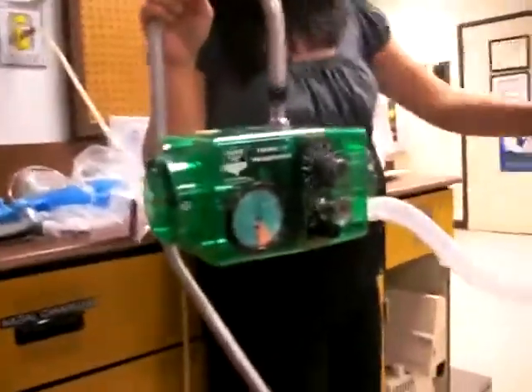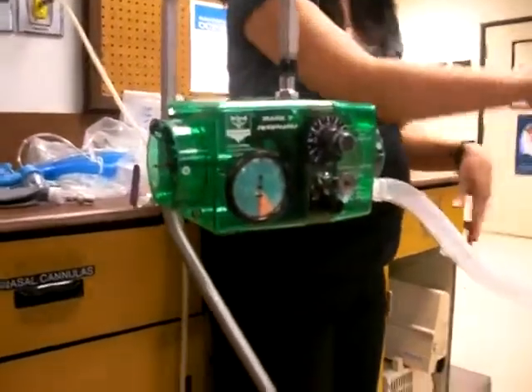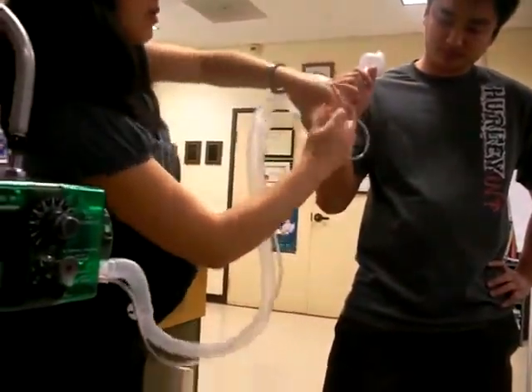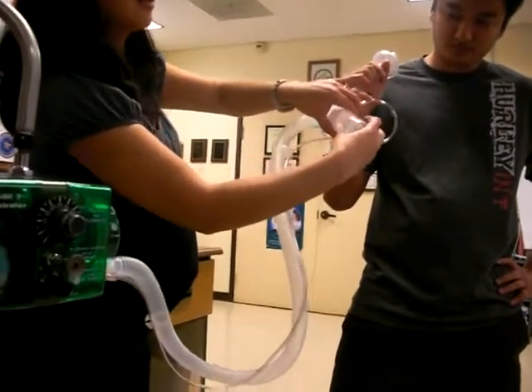Okay. Because there's a leak somewhere in the circuit. He's making a good seal, but there's a leak somewhere in the circuit. So what do you need to do? Tighten your adjustments. Everything. It could be over here too. The leak could be on the nebulizer area. You didn't thread it in properly. Okay.